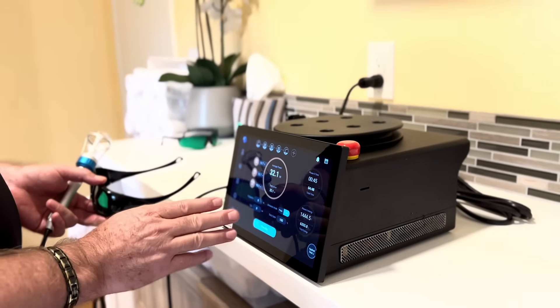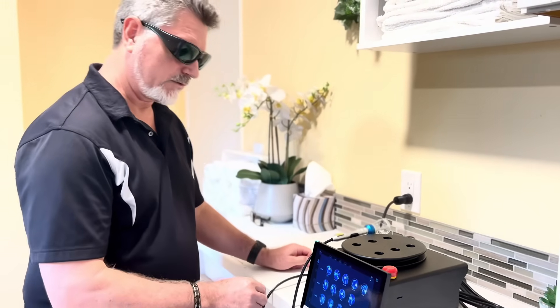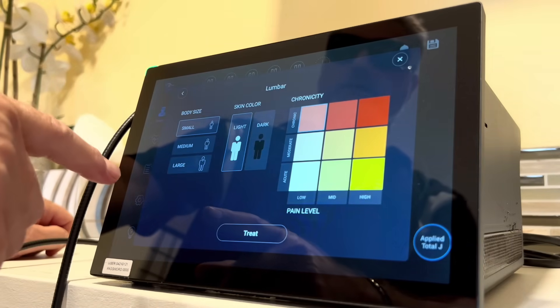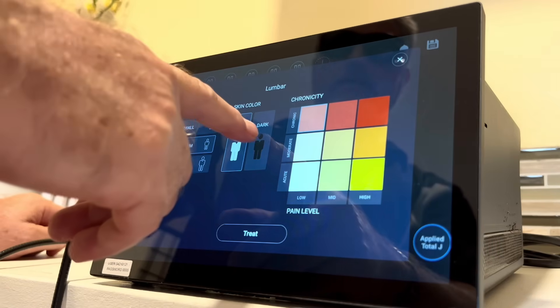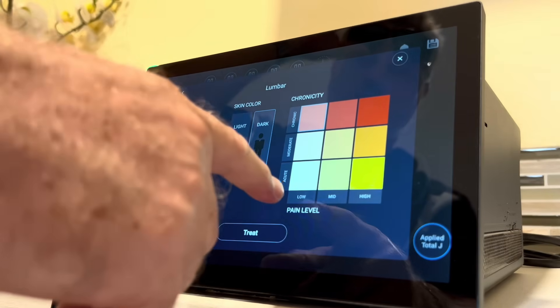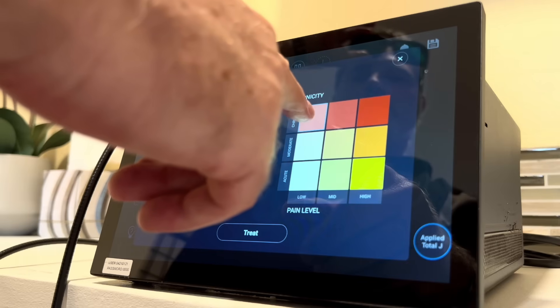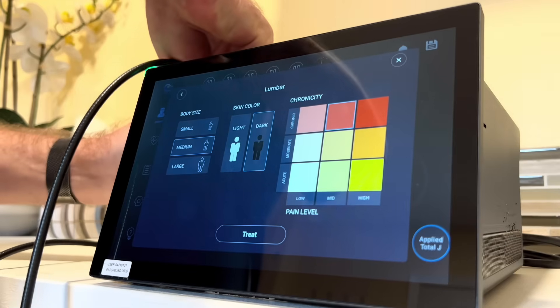All right, we're ready to get started. Let's put on our protective glasses and choose the human protocol on the touch screen. We're going to be working on Sarah's lumbar spine, so we'll choose the lumbar spine human protocol. On this screen we'll choose medium body size, darker skin color, and select the pain level and chronicity. We'll go with chronic medium pain, then move the handpiece from the cradle.